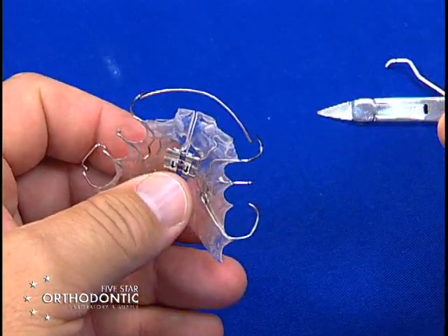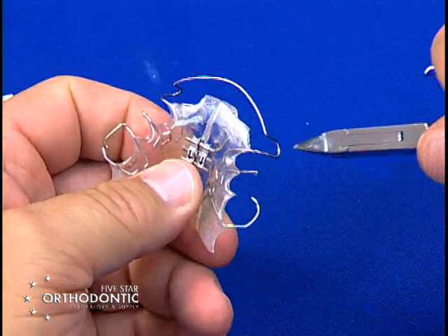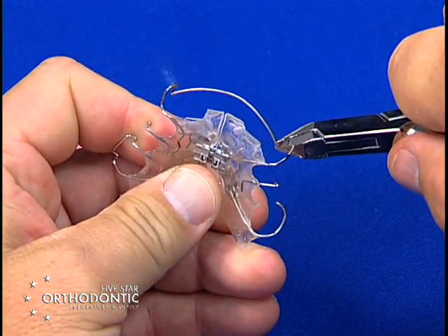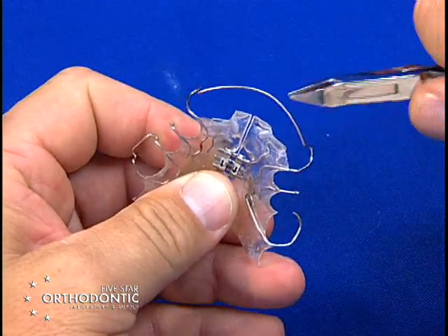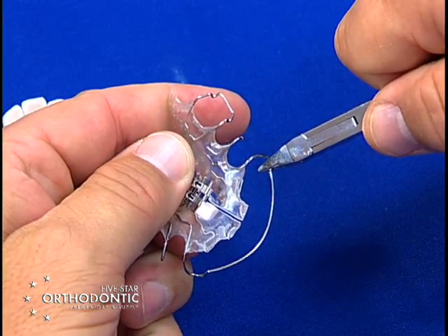There are four bends in activating a labial bow. The first bend is to place inside the omega and squeeze, which will take the bow anteriorly. You then go to the opposing side in the omega, squeeze, and it takes the bow anteriorly again.